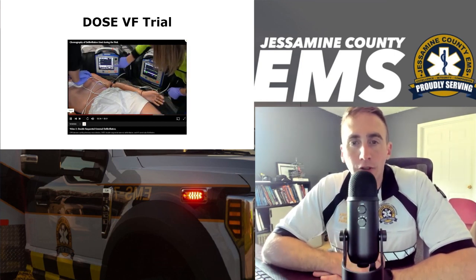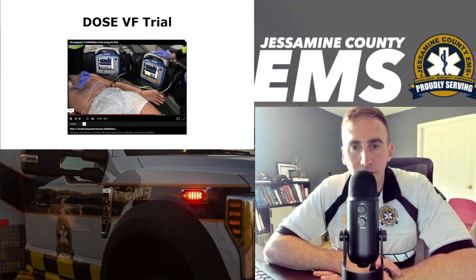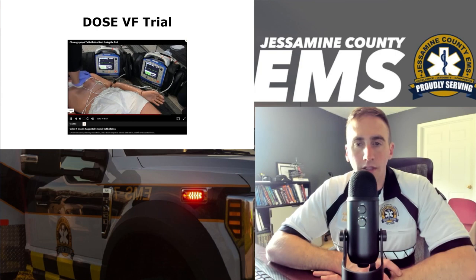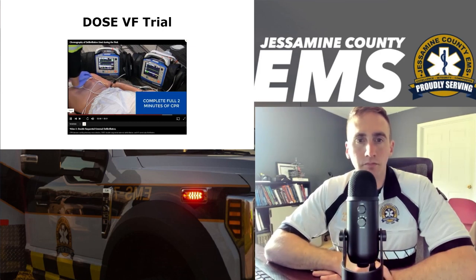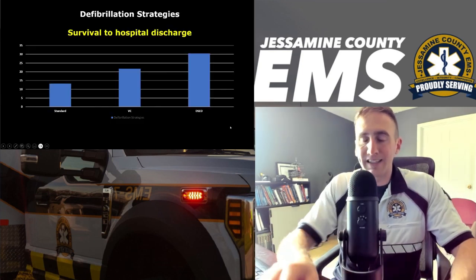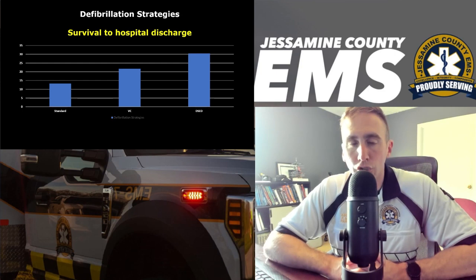Both monitors are being charged to 200. And just so you know, in our new protocol, all energies are going to be at the max energy for adults. So they hit one, then they hit the second one. And again, in their study protocol, there was roughly 1 second between them. Okay. And that is dual sequential in a nutshell. And this was one of the first dual sequential defibrillation studies to show increased survival to hospital discharge.